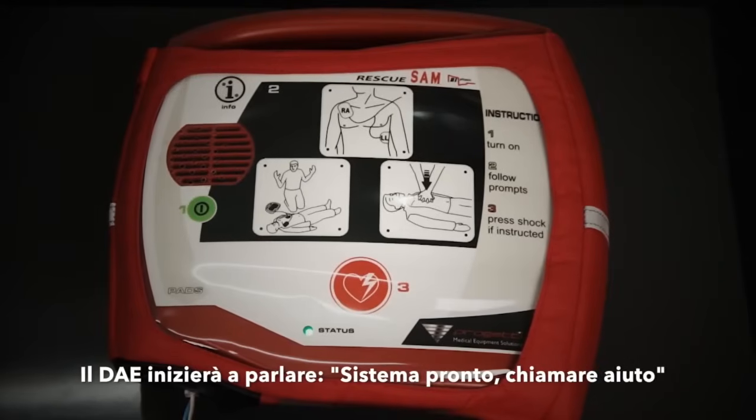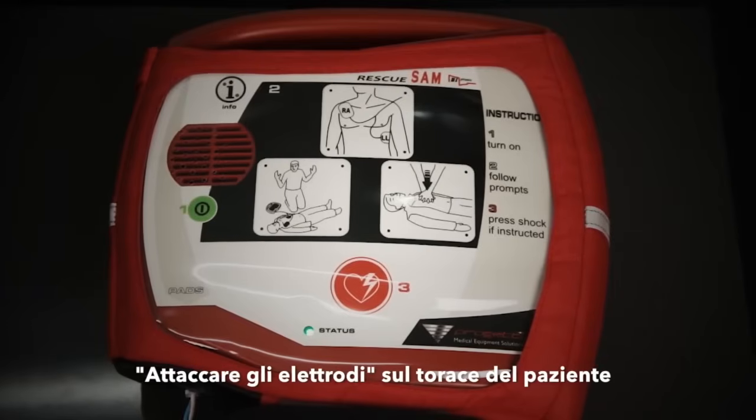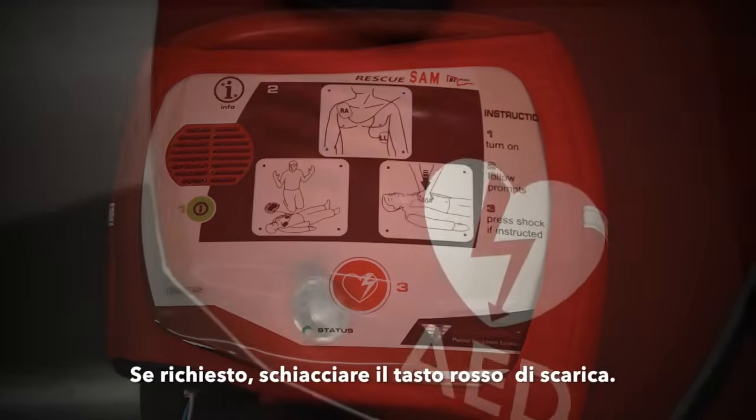System ready. Call for help. Attach pads. When instructed, press the red shock button and listen out for further instructions.